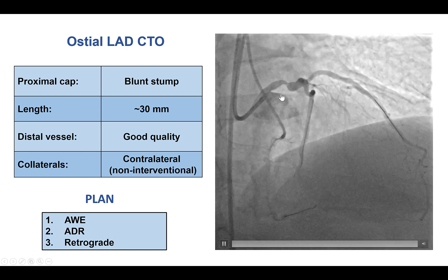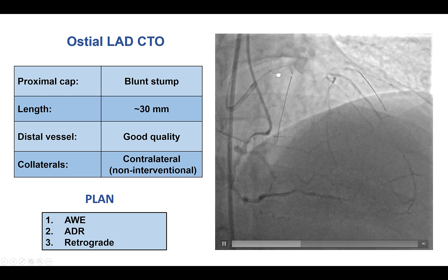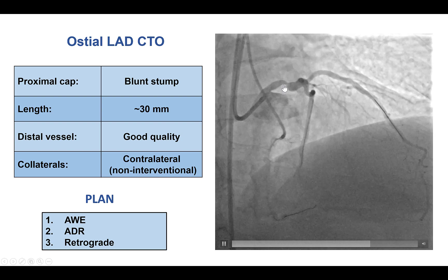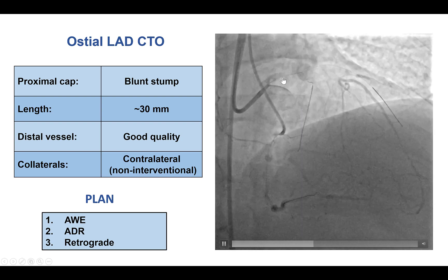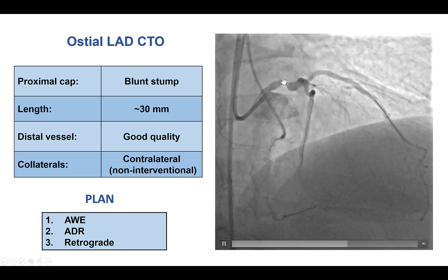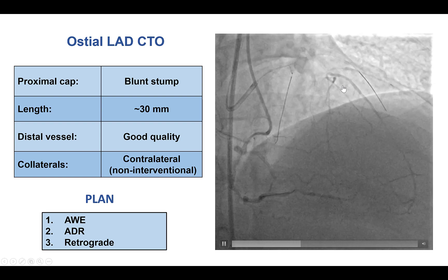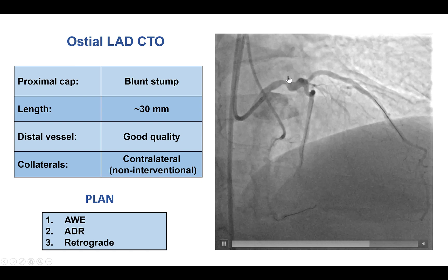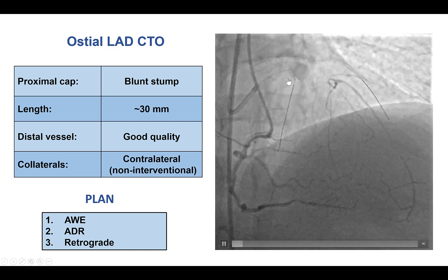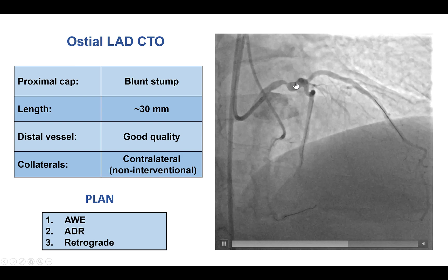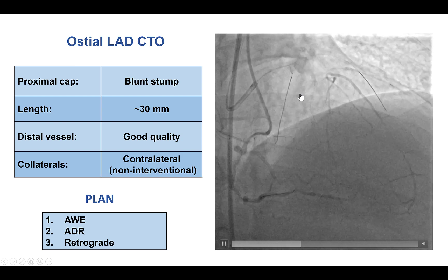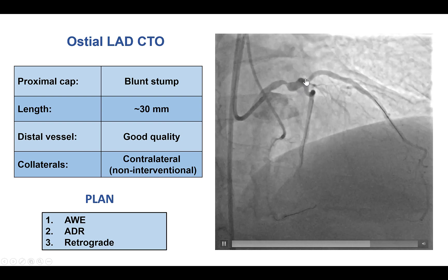Our plan was to not treat the left main first, because subsequent equipment advancement might lead to stent deformation. Instead, we would try to treat the LAD first and then stent the left main at the end of the procedure. Our plan was to use IVUS and different projections to understand the proximal cap ambiguity.